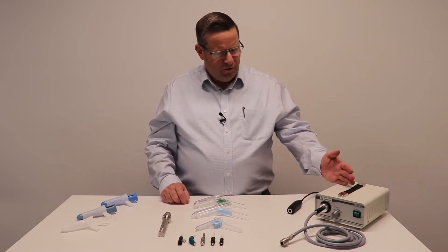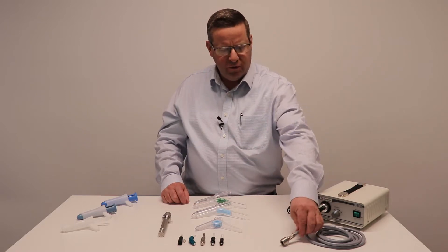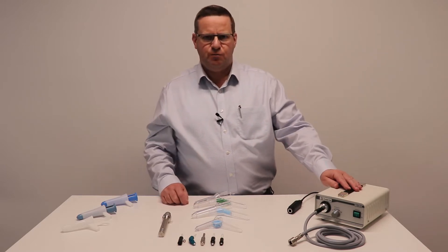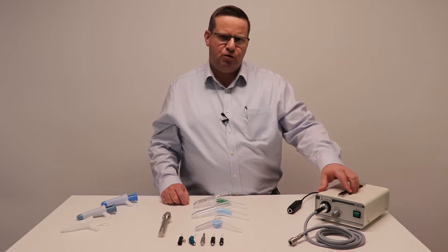Firstly, we have the fiber optic machine here — a cold light source with an autoclaveable flexible cable. This is a 150 watt halogen bulb, very bright and powerful.